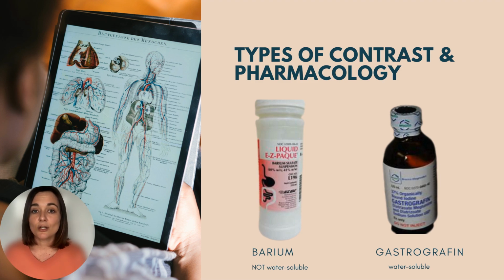It's dense, coats mucosal surfaces beautifully, and gives that crisp white outline we love. But heads up, it's not water-soluble, and it's not safe if there's a suspected perforation or risk of aspiration. Next up is water-soluble iodinated contrast, like Gastrografin. This one's safer for high-risk situations like post-surgical patients, suspected perforation, or aspiration-prone patients.